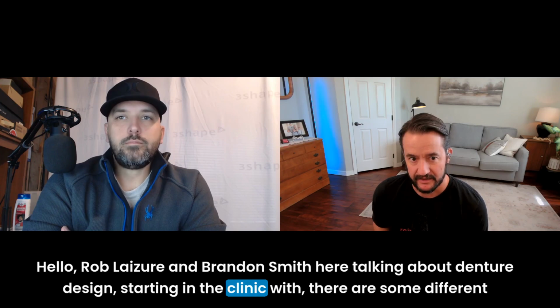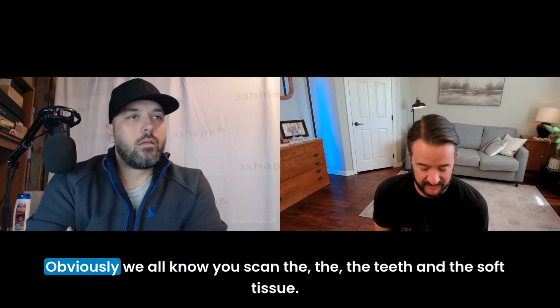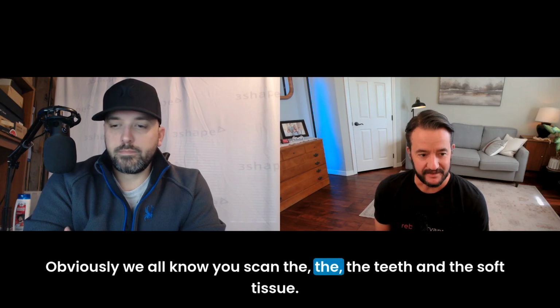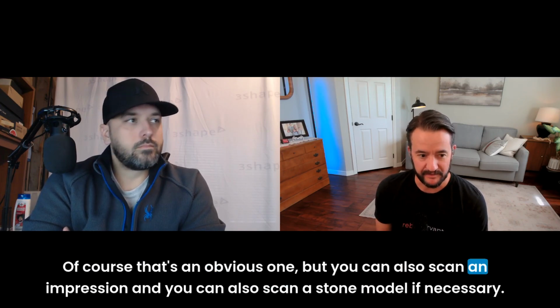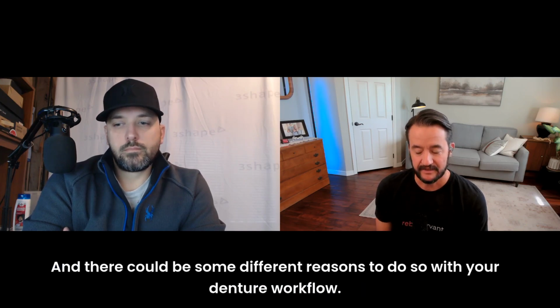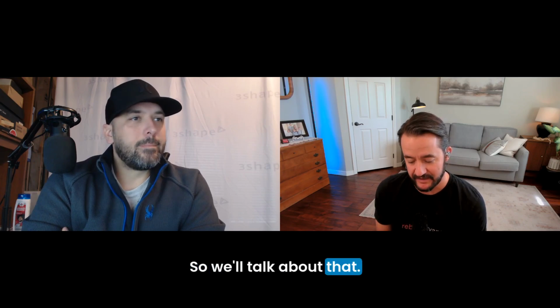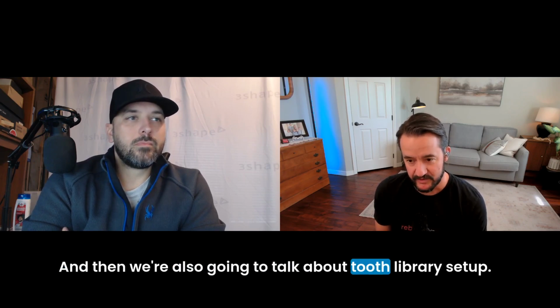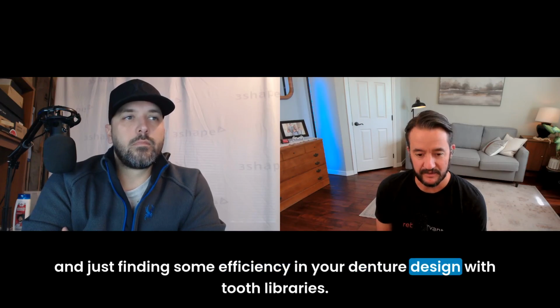Starting in the clinic, there are some different object types you can scan. Obviously, we all know you scan the teeth and the soft tissue. Of course, that's an obvious one, but you can also scan an impression and you can also scan a stone model if necessary. And there could be some different reasons to do so with your denture workflow, so we'll talk about that. And then we're also going to talk about tooth library setup and just finding some efficiency in your denture design with tooth libraries.